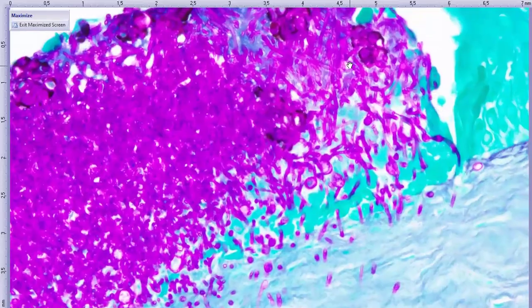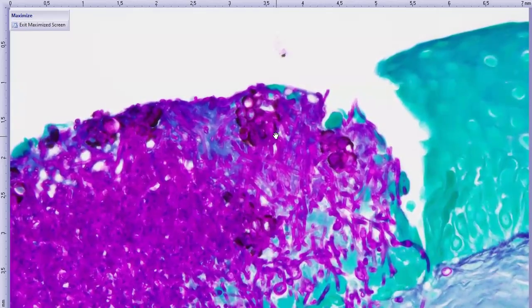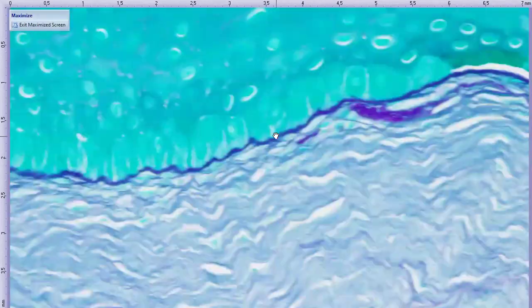It's fun that it has all these conidia forms. You often see those when these fungi are exposed to air, which makes sense here on the very surface of the cornea, or when you have those big pulmonary cavitary lesions where there's access to oxygen.